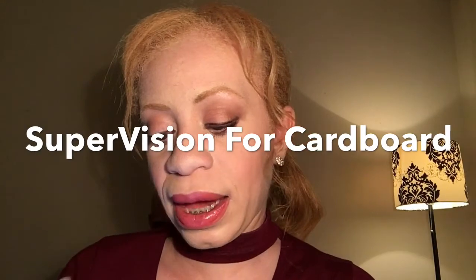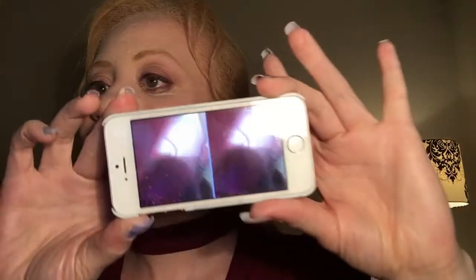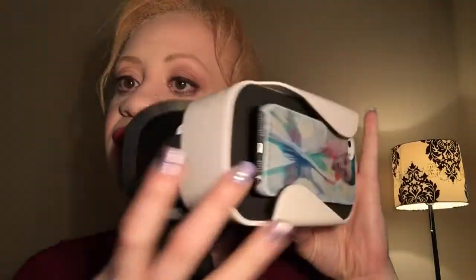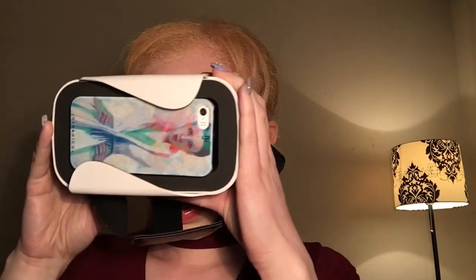Supervision for Cardboard is the name of the app in the Apple Store. I'm going to open it and give it permission to access my camera. You can see it gives a view for both eyes. I'm going to place the phone on the inside of the headset facing back like this. I was worried about whether it would fit — but I've got it in and it looks like a good, sturdy, snug fit. I've got a case on my phone and there's still enough room. Looking through here — oh my gosh, this is pretty cool!